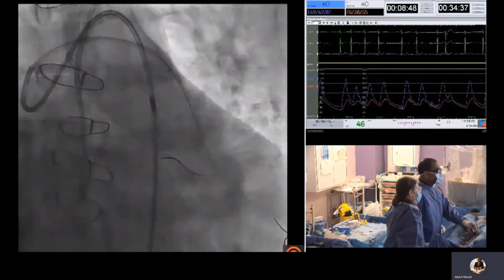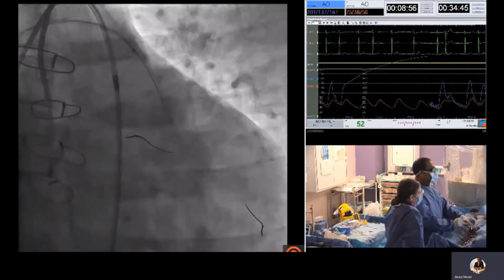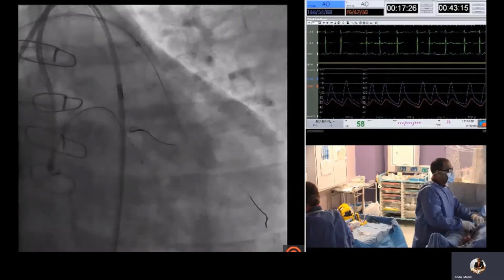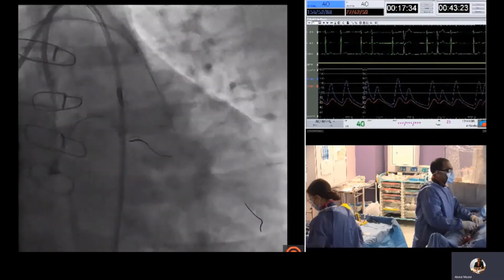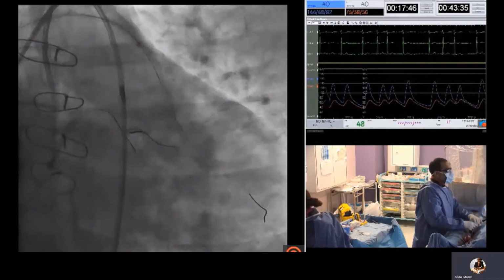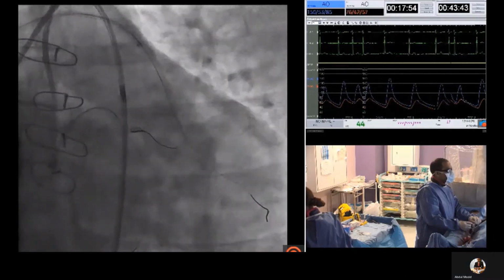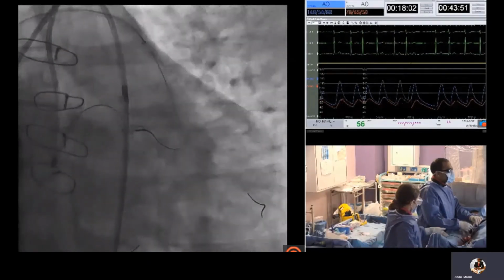So we then take a picture from the antegrade guide catheter to clarify where we are. And we can see that we are at the proximal cap of the occlusion. So using this then as a marker, we then used a Twin-Pass dual lumen microcatheter to try and puncture this angled proximal cap. And the dual lumen catheter allows you support to try and puncture these types of caps, which can be difficult, especially when near flush occlusion, where it's difficult to get support with a standard microcatheter.